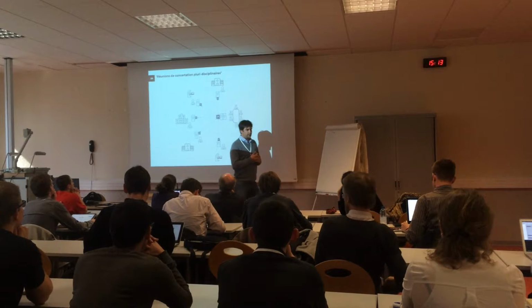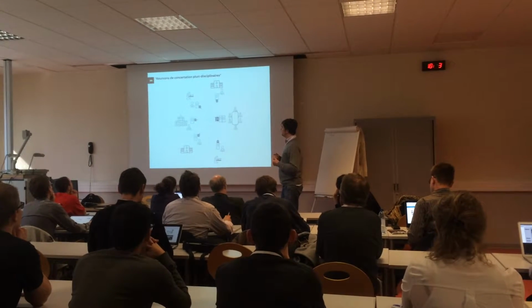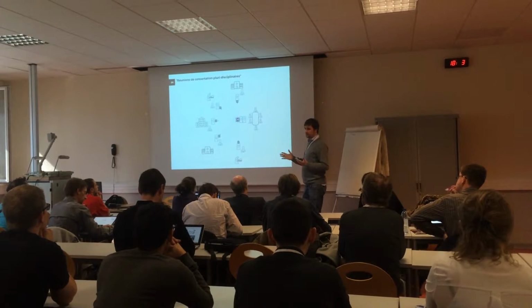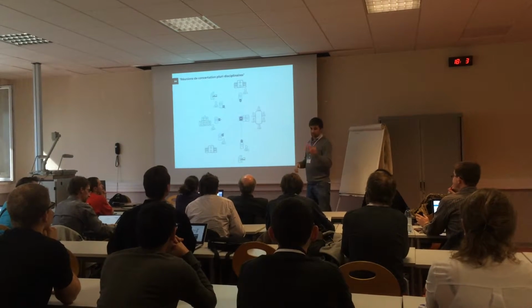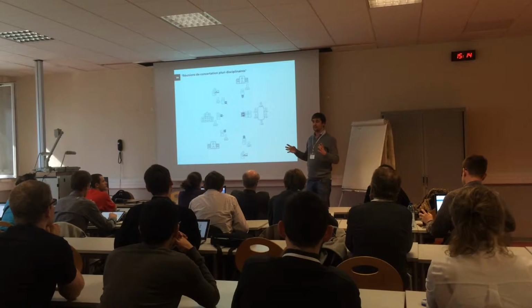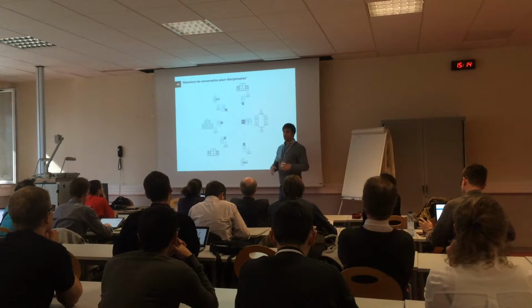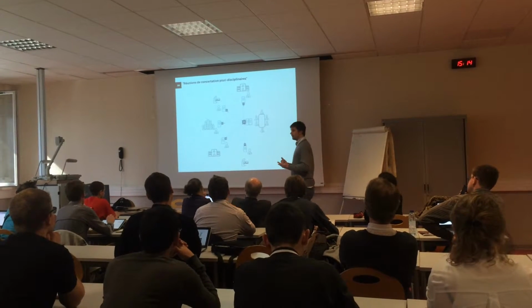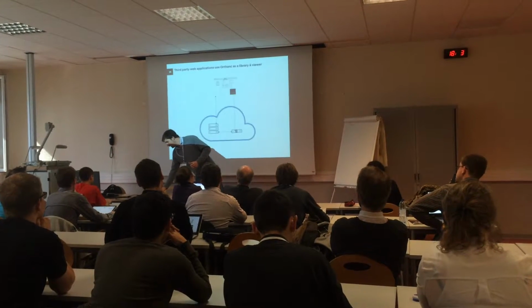Another instance is a vendor that has used Orthanc to enable multidisciplinary, I don't know how to say that in English, but multidisciplinary. The tumor board, exactly. So basically, different Orthanc instances are being organized so that they send a specific set of images to one centralized Orthanc instance, and then the tumor board can have a look at those images, and they don't need to drive around or to meet physically.